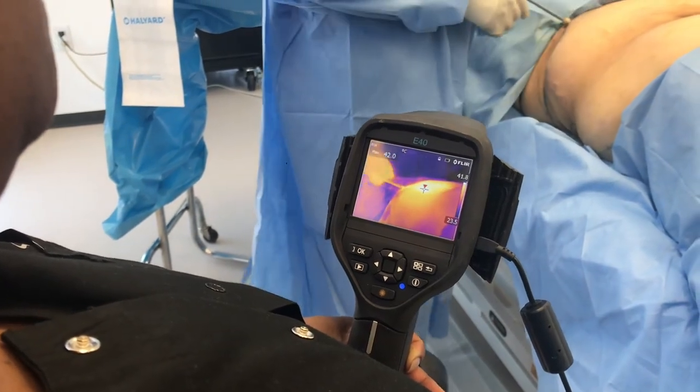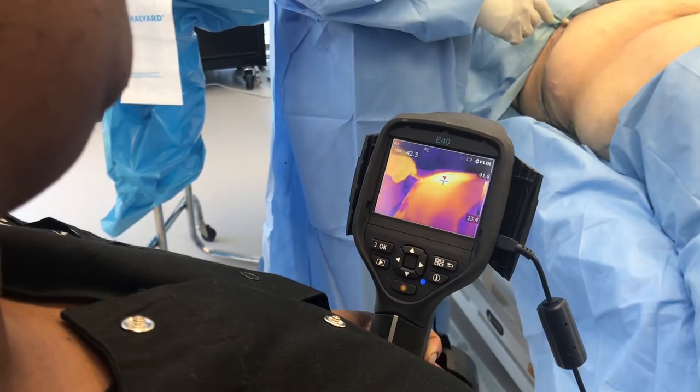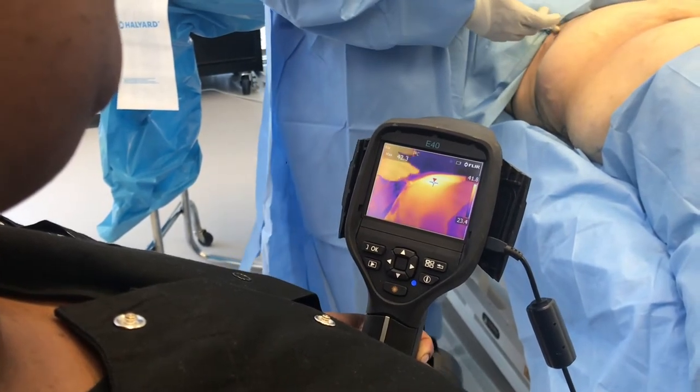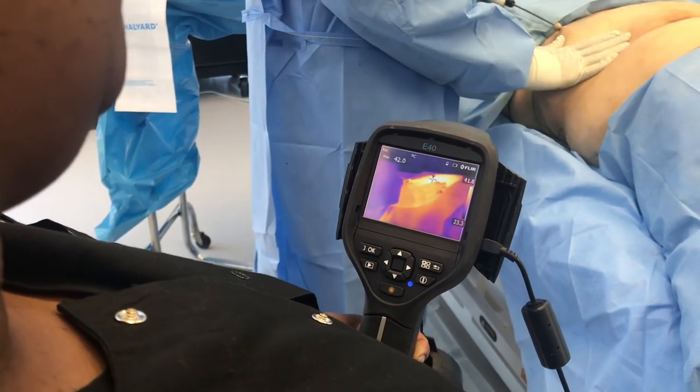Now, what is the temperature in this particular area? It's 42.2 degrees. That's sufficiently hot to stimulate collagen remodeling — you need to get to 42 or 43 degrees. I'm going to still heat it up a little bit more.